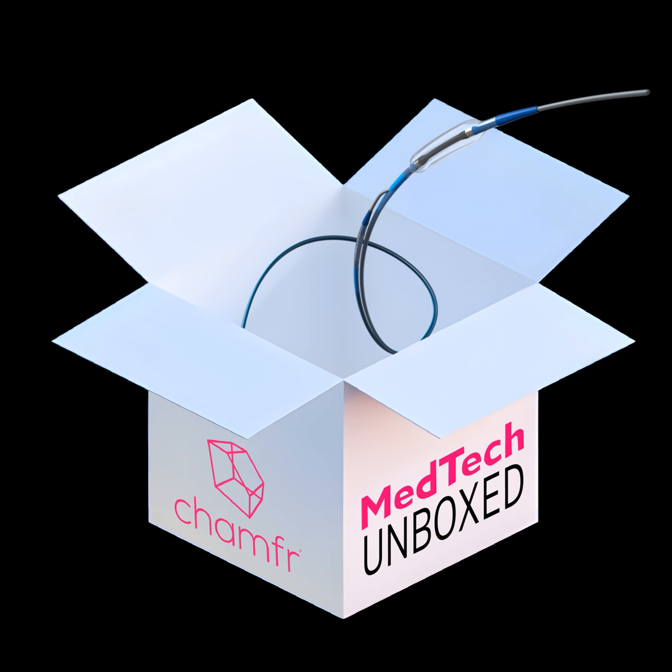I know we've been talking a while, and I've been following all the LinkedIn posts about the latest status of VirtuCath, and I'm really looking forward to digging in deep on it and actually having you show us a few examples. Sounds great. Let's go.